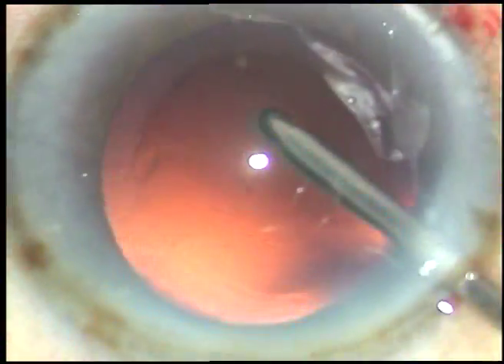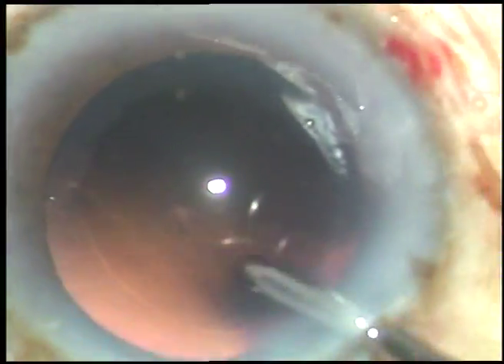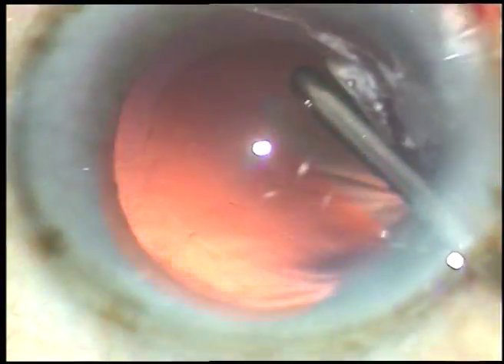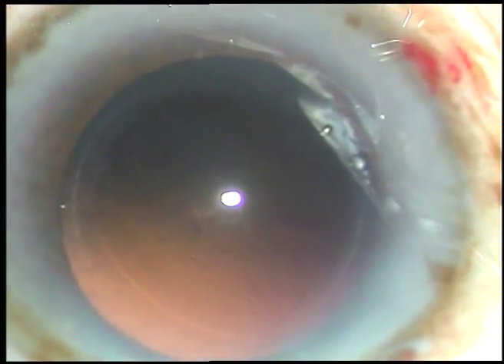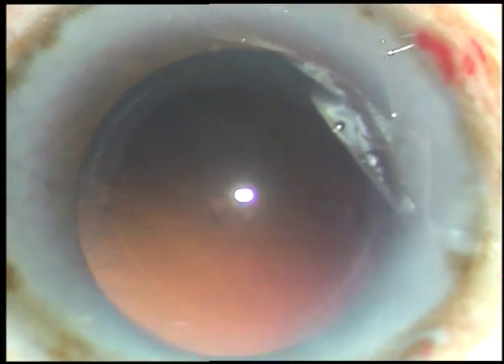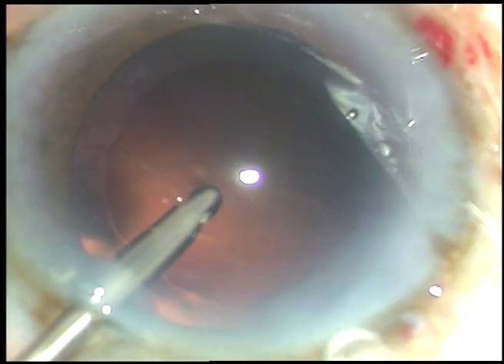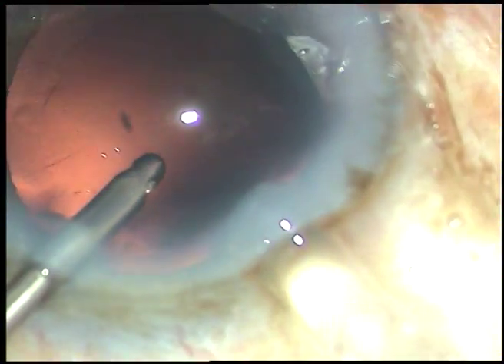This is hydropolish. The irrigating probe of bi-manual IA is used to polish the posterior capsule using only the irrigating fluid. The irrigating jets are directed towards the posterior capsule where cells are sticking — the cells get dislodged and nice polishing occurs in a very short time. Now this is the intraocular lens.